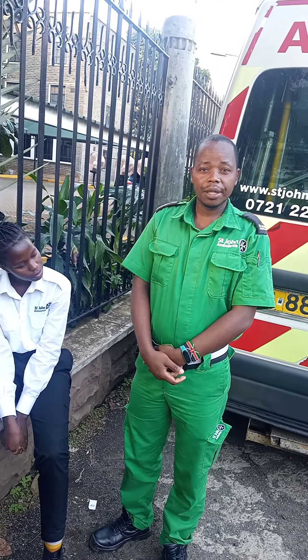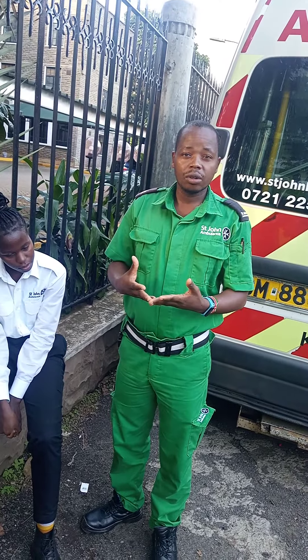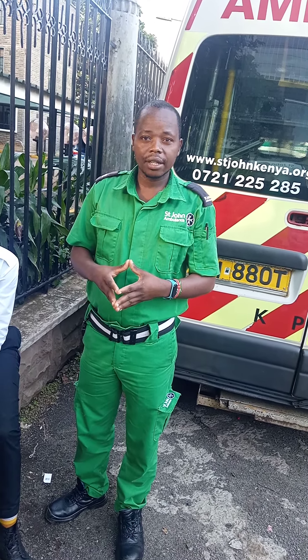My name is Peter Kome. I want to teach you a tutorial on how to apply a tourniquet. A tourniquet is a device used to stop the flow of blood from the veins or arteries. Once used properly, it is considered for use during emergencies.